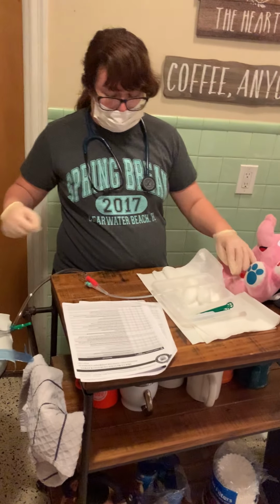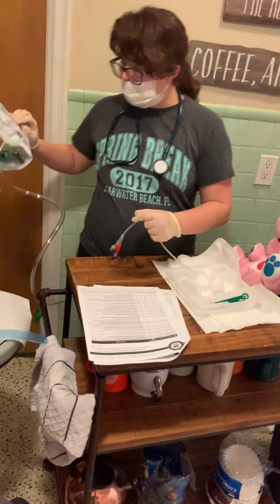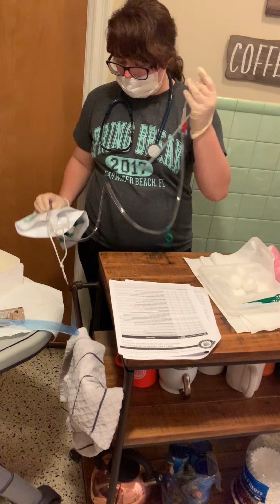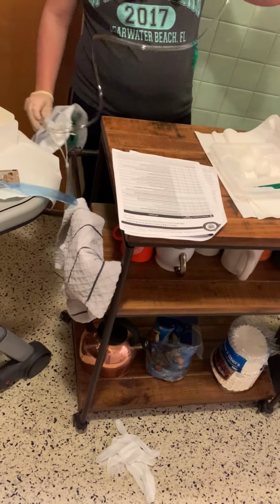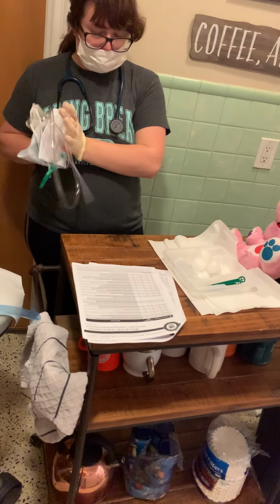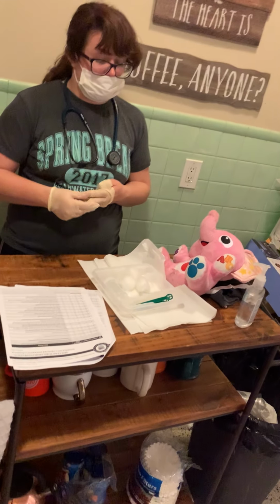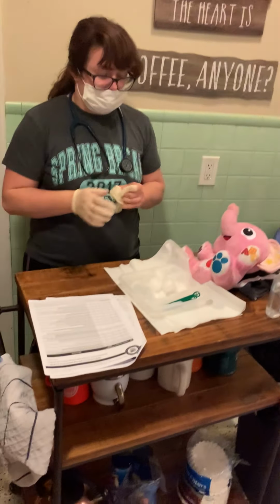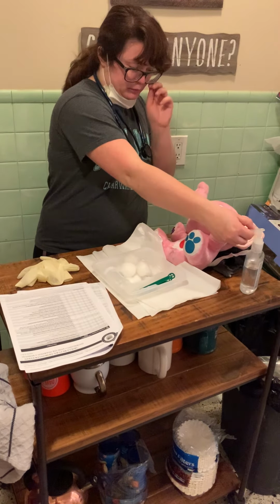The drain bag should be hanging on the side of the bed and clipped on, and it should be lower than the bladder to make sure that it's all draining properly, and there shouldn't be any kinks in the tubing. I'm going to raise the side rail of my patient's bed, remove my gloves, discard them and any of my supplies, and then I'm going to perform hand hygiene.